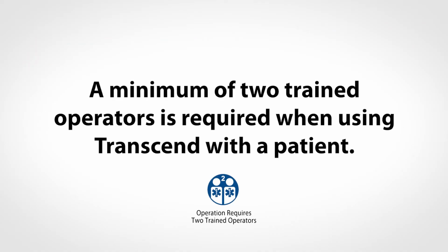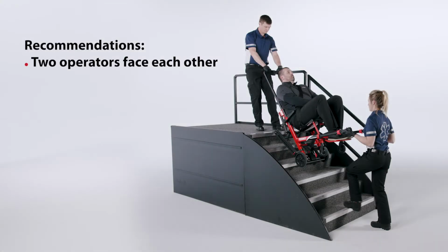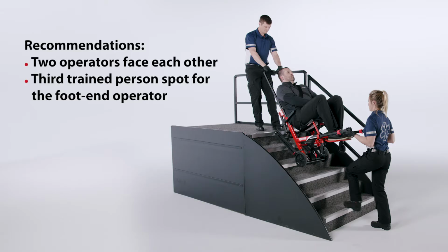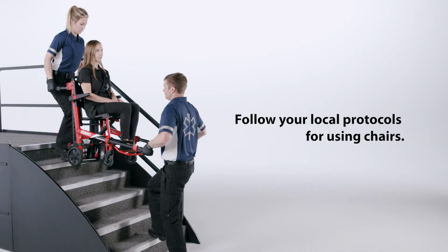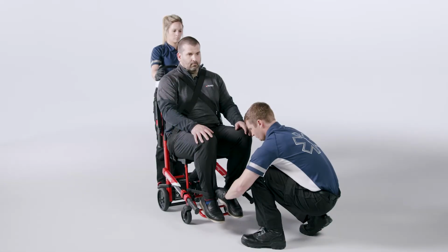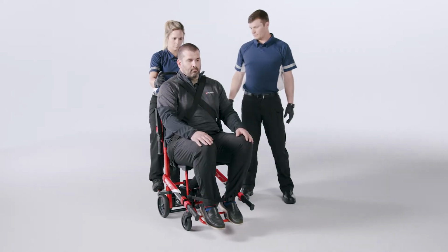A minimum of 2 trained operators is required to use the Transcend chair with the patient. It is recommended that the 2 operators face each other when transporting a patient on stairs, and that a 3rd trained person spot for the foot end operator. Follow your local protocols for using chairs. Verify the patient is properly restrained before transporting a patient up or down stairs.